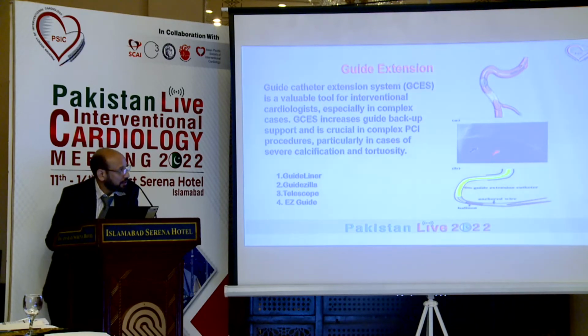So guide extension. Guide catheter extension system is a valuable tool for interventional cardiologists, especially in complex cases. Guide catheter extension system increases guide backup support and is critical in complex PCI procedures, particularly in cases of severe calcification and tortuosity. So some extension guiding catheters are like GuideLiner, GuideZilla, Telescope, Easy Guide.